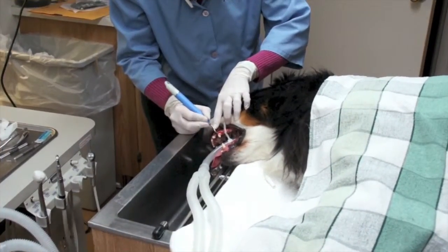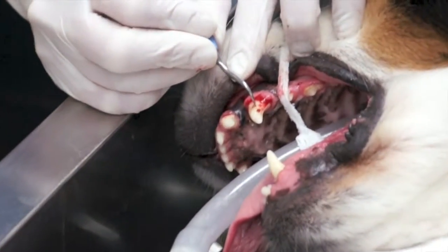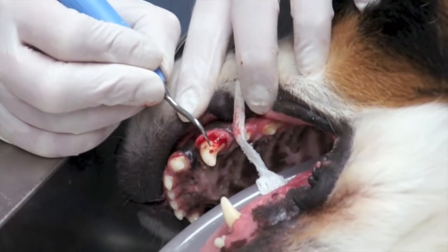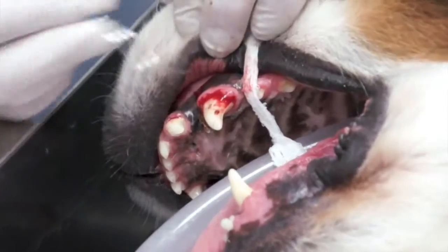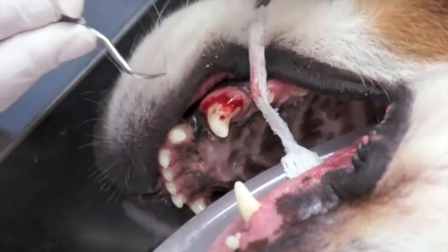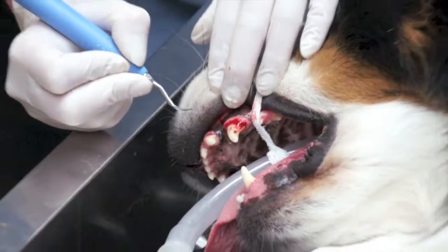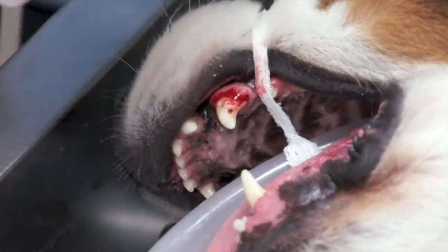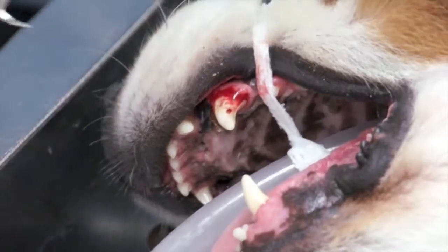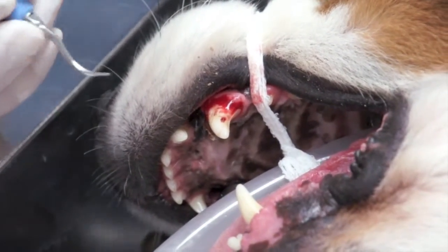You will hold your scaling head at an angle when you are doing a dentistry. If you hold it too head on, you can burn the enamel off your tooth. You definitely don't want to do that. Even though this is ultrasonic, I'm still going to do a side motion with my hand just to help along the dental itself, so this can go by a little bit faster. Again, you don't want to stay too long for a period of time right on one tooth. And when I do scale with this particular head, you will find that water will come out of here, which will help, again, prevent us from burning the enamel of the tooth.